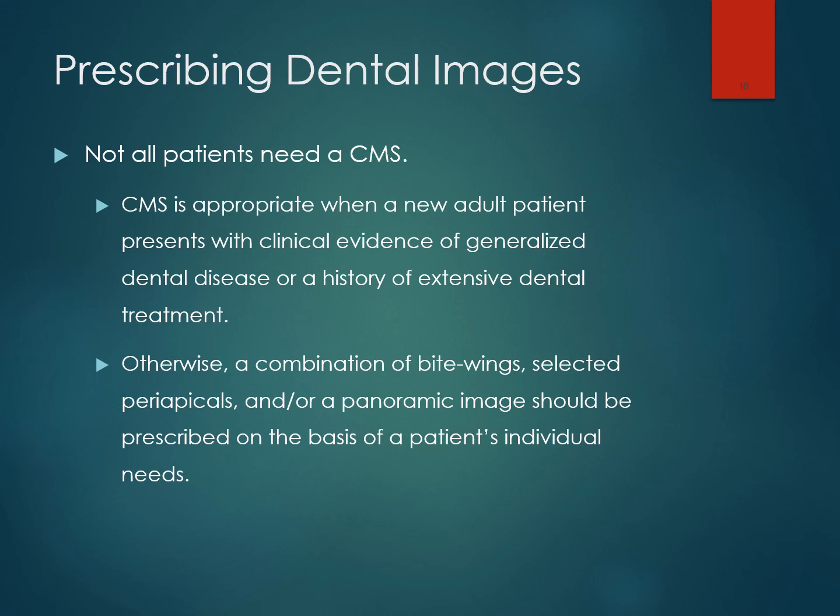If our patient comes in and they are 20 years old and they've never had a cavity in their life and they did have their wisdom teeth removed, then maybe we're not taking a complete mouth series on them. We're just going to take 4 bite wings and 3 PAs and maybe a pano, maybe, right? It really depends on the patient.